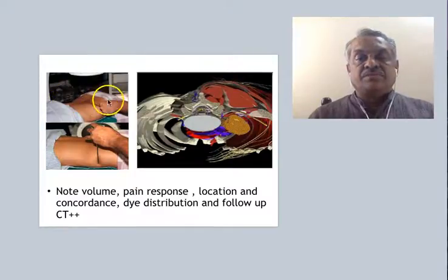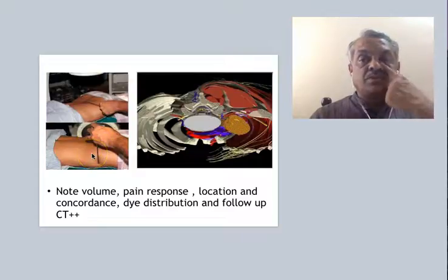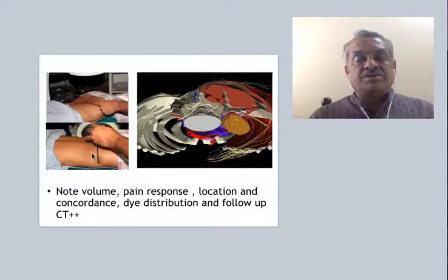We are putting the patient prone, we mark the midline. Under fluoroscopy we take the disc space as is seen in AP. In lateral we measure the depth and then go towards the head with the inclination and mark the point above the line, which nowadays we have come to about 12.5 centimeters, which is the right point for entry for the surgery. For the injection or discogram you could always go at 9.5 centimeters from the midline. Now the needle goes paraspinal, intramuscular, below the facet, behind the psoas, behind the peritoneal sac, in the foramen.